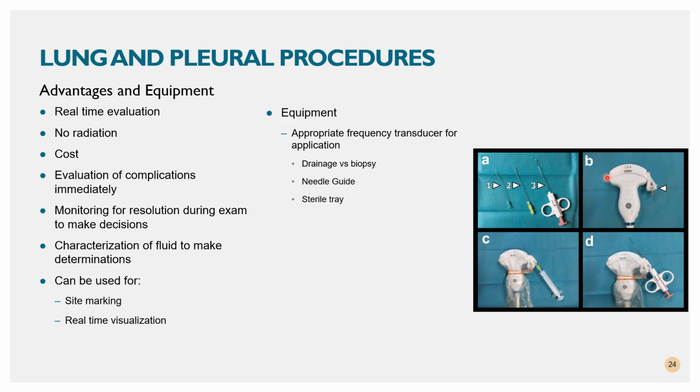These would be just sterile guides that you can add to your transducer, which allows the needle to stay in position in the line of the sound beam the whole time, rather than trying to maintain keeping your needle aligned with the long axis of the sound beam, which can be rather challenging, especially if you're newer to ultrasound.